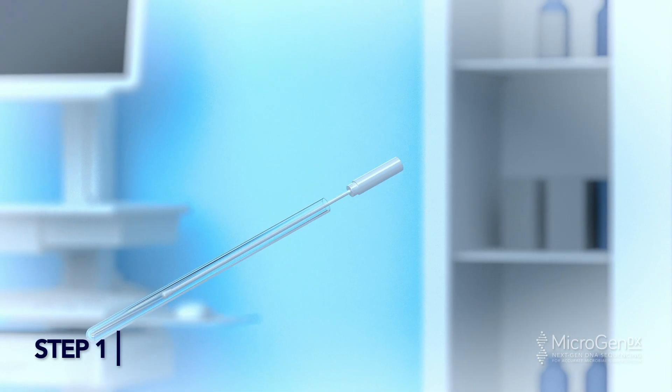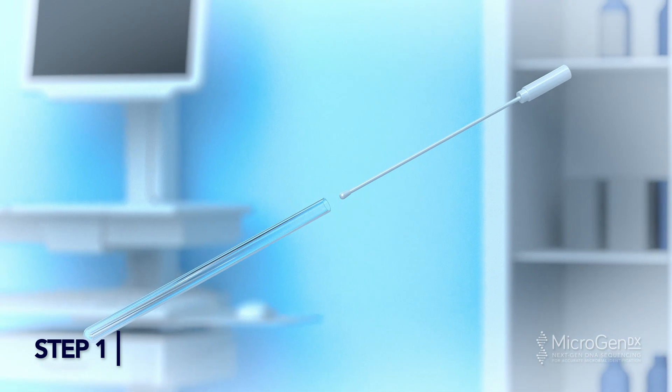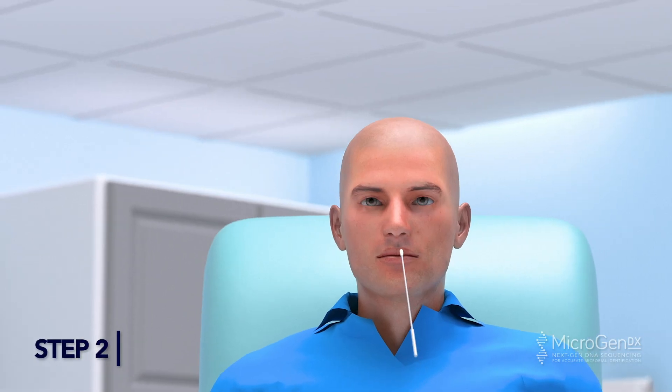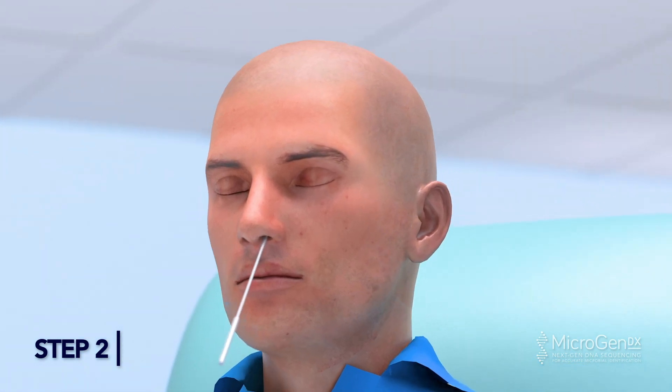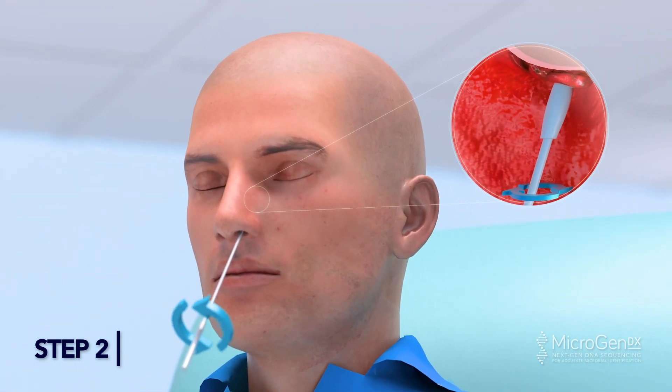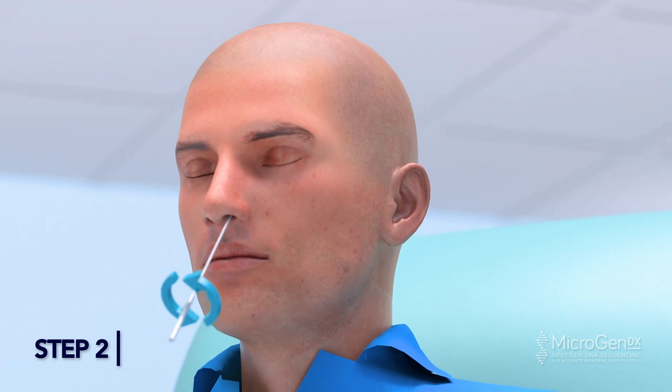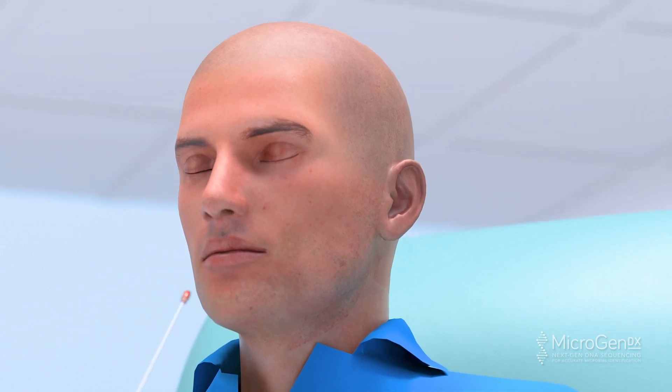Swab Method, Step 1: Twist the cap at the dotted line to open the tube. Bend the swab stem if necessary. Step 2: Gently insert the swab into the nostril and swab the inflamed area. Rotate around the inflamed area of the nasal cavity a few times.